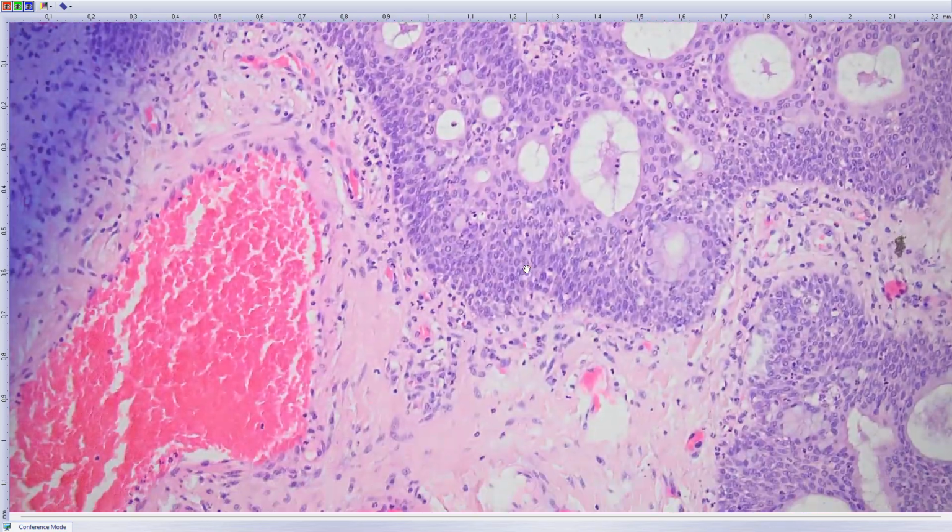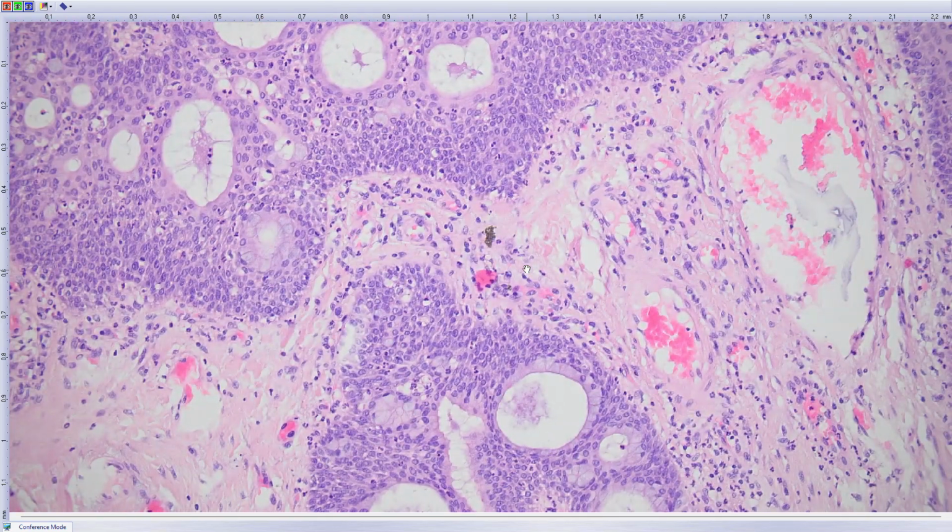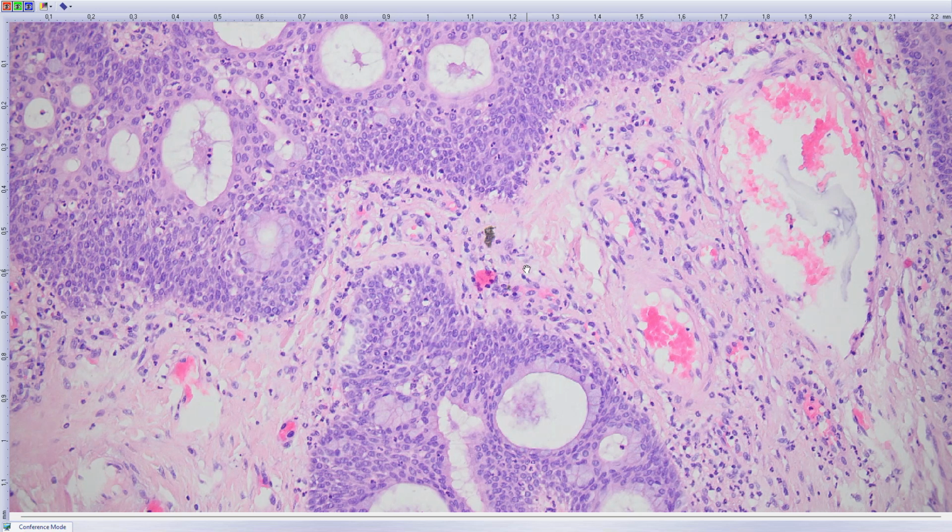And you have many of these lesions, and we think that these lesions might be an incipient stage of nodular hidradenoma, which very often arises in epidermis in lesions that look like that. We still didn't do genetics. We are about to do it in the coming weeks.